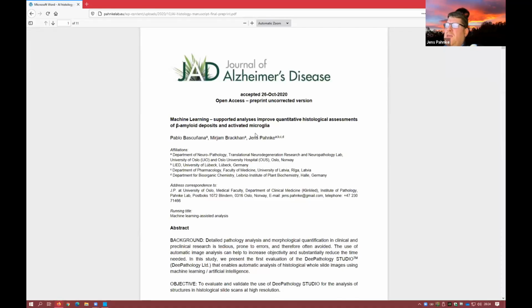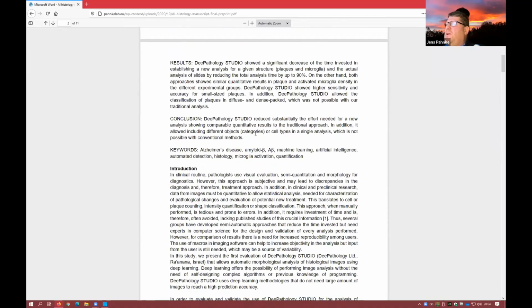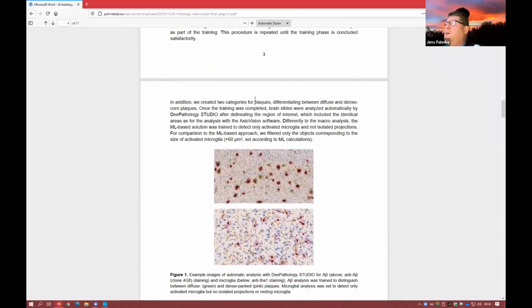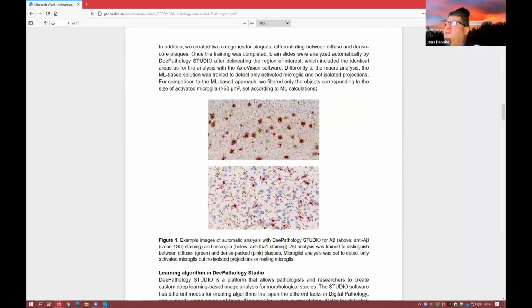It is a system where you can segregate pictures according to grayscale, colors, for example, and finally you end up with black and white pictures that you measure. You can determine plaques, you can determine microglia. So we programmed this. The programming with such a tool already takes very long, approximately 2 to 3 days. Here in the AI, you have seen it's very fast.